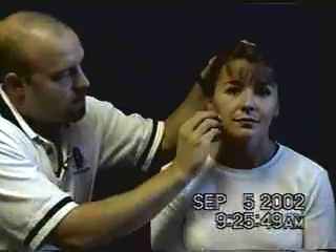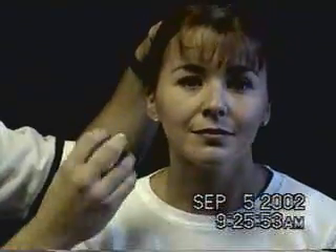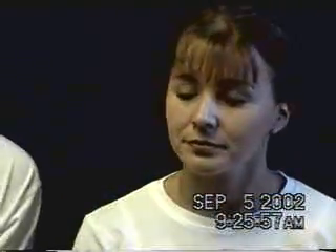Then we're going to scrub the area over the masseter. Make sure we get all of the makeup off — just keep checking the gauze until it's clean. Then we're going to let the skin dry. Normally with a 90% solution it only takes about 30 seconds.